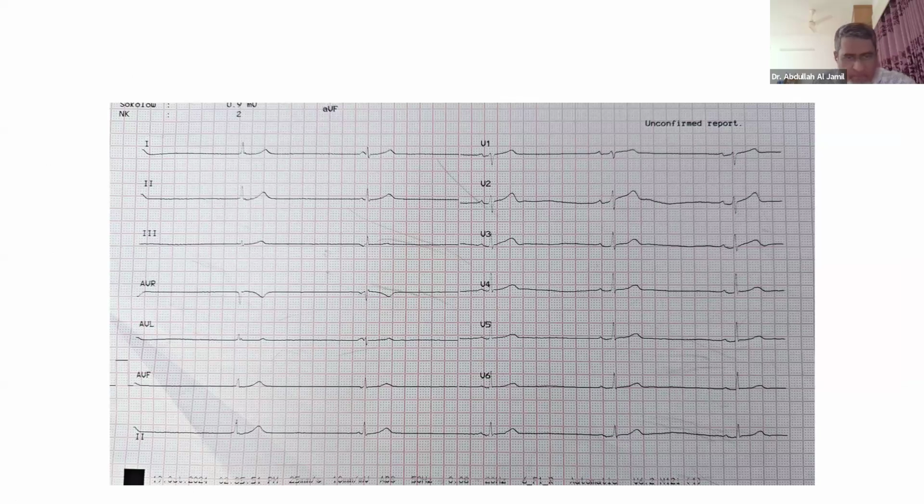In this ECG, if you look at the lower panel, the rhythm strip, the first complex does not have any preceding P wave. The second complex has a small P wave with short PR interval without delta wave. The third one looks normal. The fourth one has a little bit of prolongation of PR interval, but it is within normal limit, as well as the last one. Difficult to comment. Shafique?